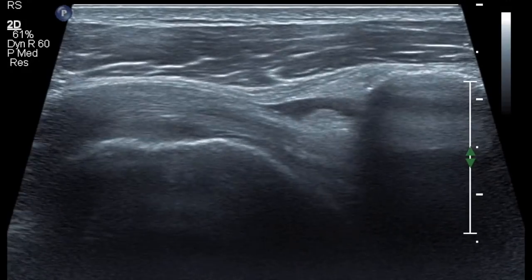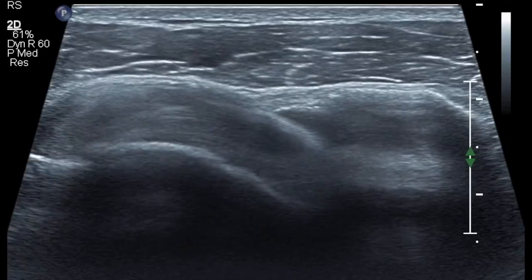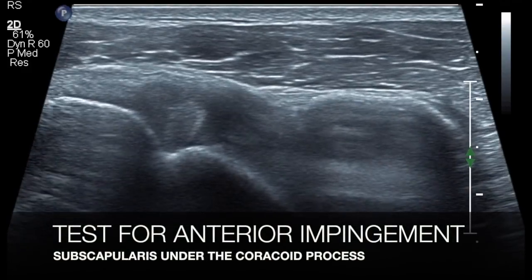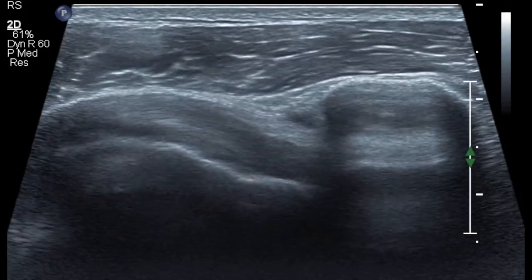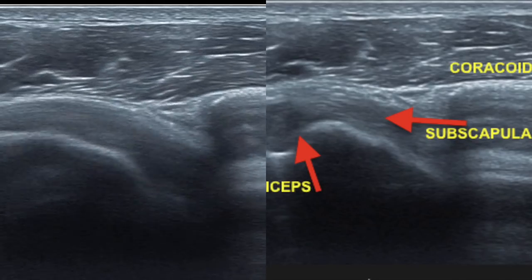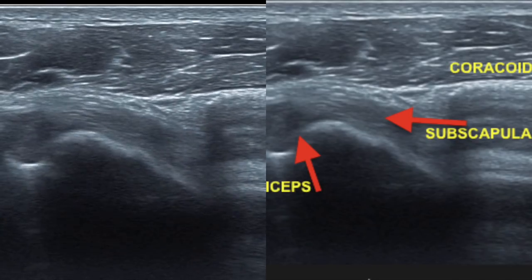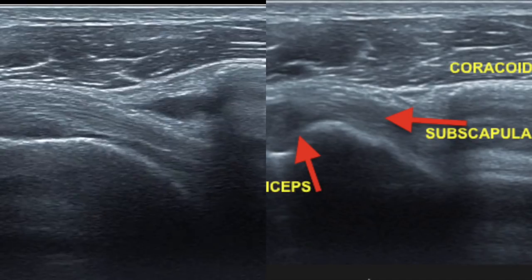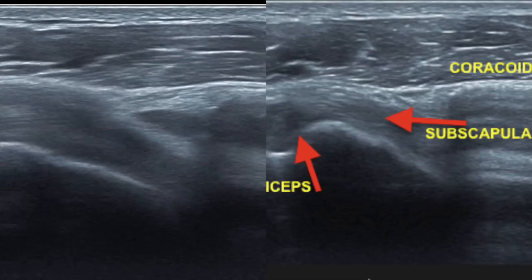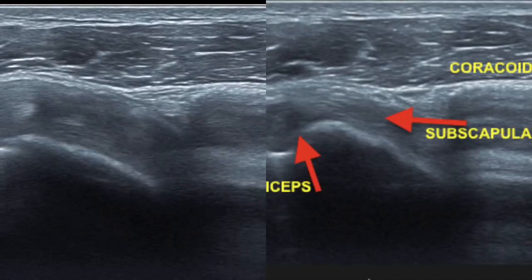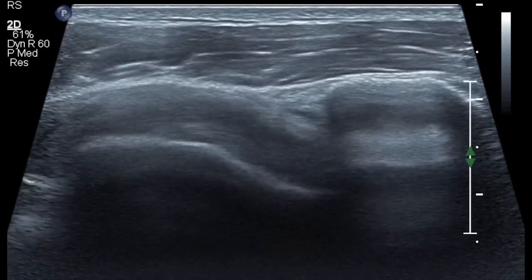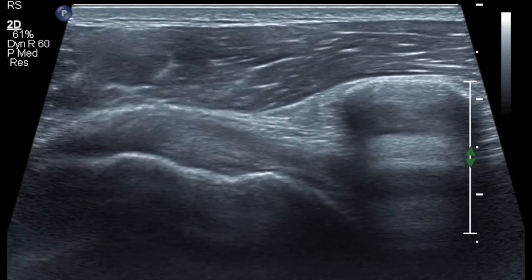As you can see in this video, you can also look for anterior impingement, which happens under the coracoid. With external and internal rotation of the forearm, the subscapularis glides beneath the coracoid. This gliding movement has to be appreciated in a dynamic maneuver. Thank you.